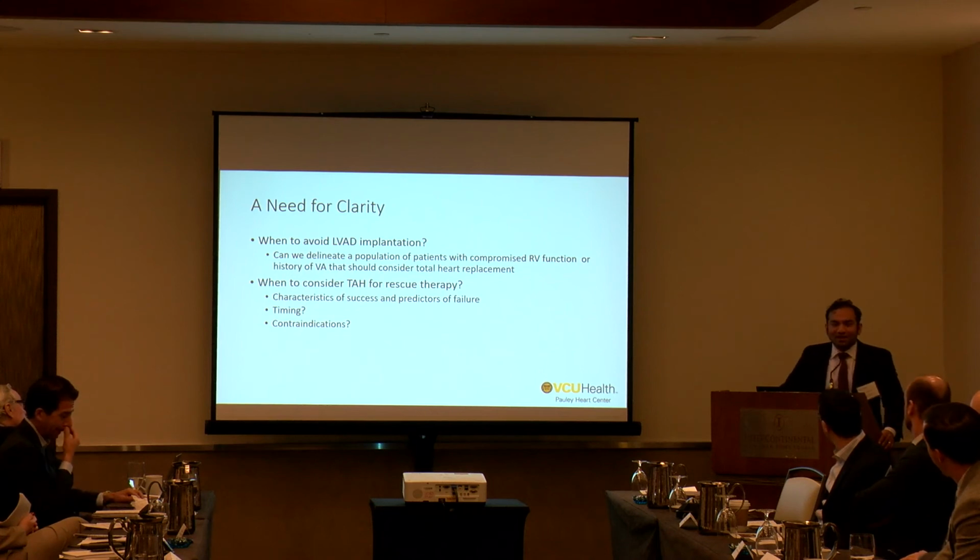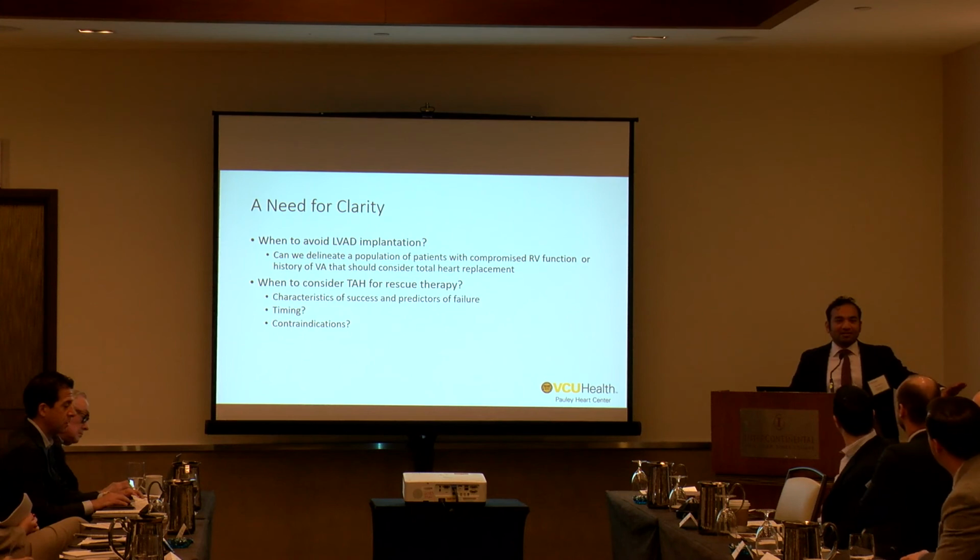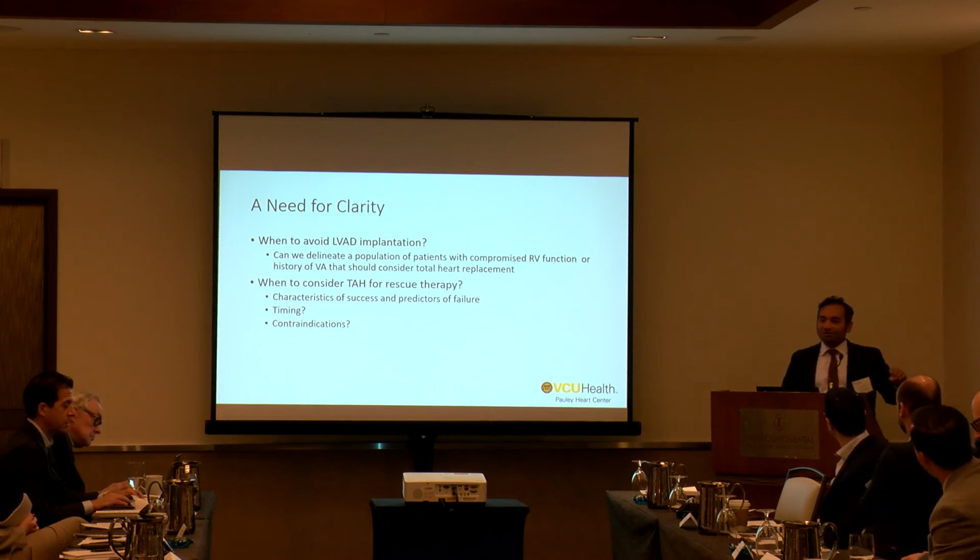Yeah. So the dialysis question is kind of loaded. We are very hesitant to put any device into a patient, LVADs or TAH, with dialysis. So let's put the LVAD stuff to the side. We've published, and everyone's published, a high rate of infection and stroke, but we still do it. We all do it. Everyone's guilty.